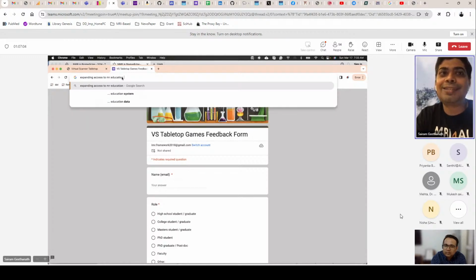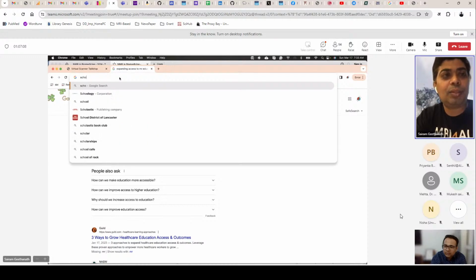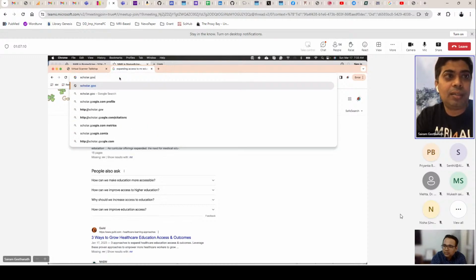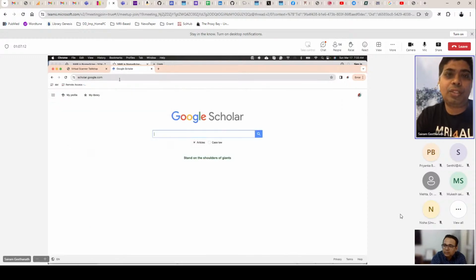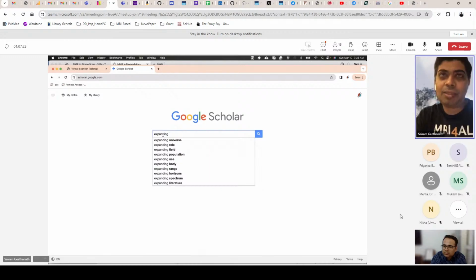But I don't know if anybody has done it with games. That's our USP for what we are doing. But if you just want to look at a simulator, which is very good, Gemris. I know Bhairav is on this call too, and I'm sure he must have used a bunch of simulators. If he wants to add anything, but I like Gemris. I know recently they have a simulator where you can actually put in a Pulseq file and generate things as well.